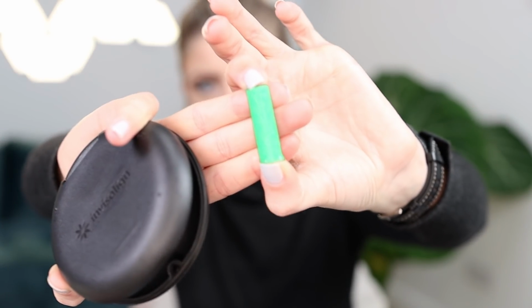And this thing here is called a Chewy. Again, you may have seen it, you may not have seen it. When you pop your Invisalign in, you have to chew like that. Not hard, but just chew on your Chewy to make sure that all the attachments are clicked into place properly, because you should be hearing clicks when you slide it in. I'm not going to take my Invisalign out today, by the way, because it's actually still quite difficult for me.